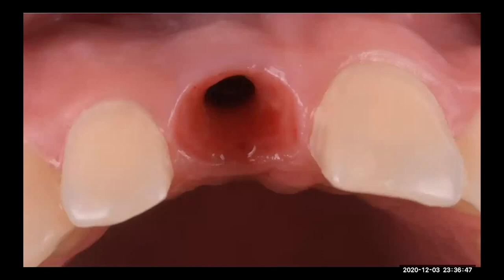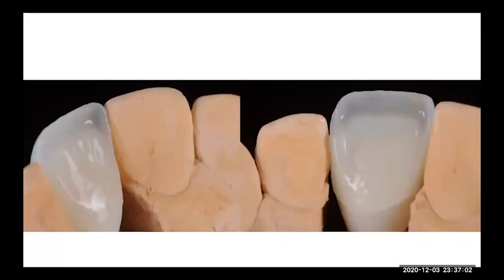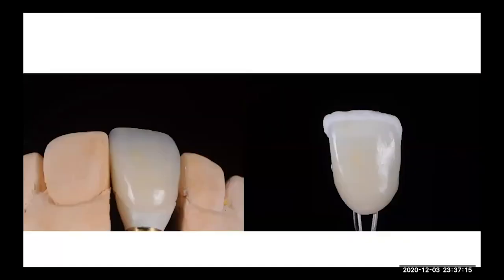Of course, we follow all the protocols and capture whatever we need to give him whatever he needs. So this is all the great job he did with his temporary. And this is our crown over our zirconia abutment. You see some different colors in the scoop portion. Then we follow all the steps with our enamels.